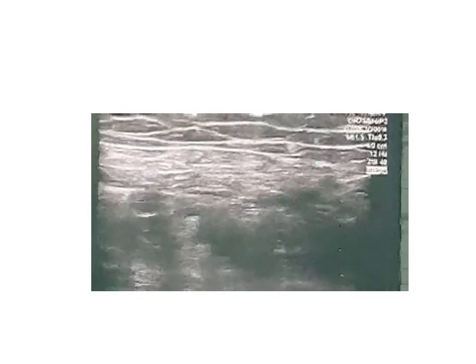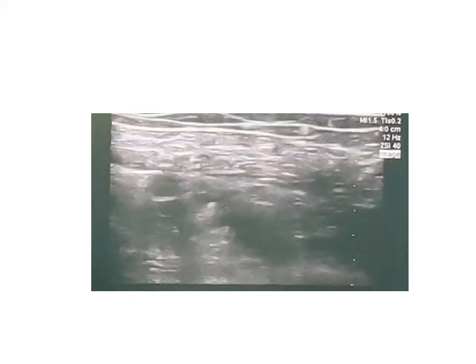Give me 5 ml more because you give extra within the adductor canal. So we need 20 ml within the adductor canal, because the capacity of the adductor canal is around 20 to 30 ml. Okay, this is finished.